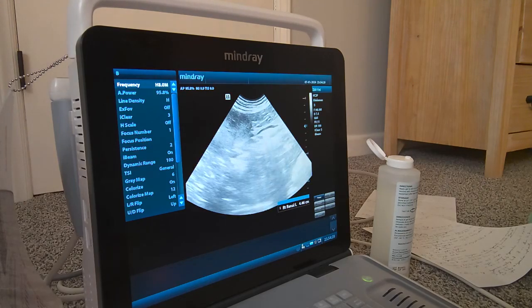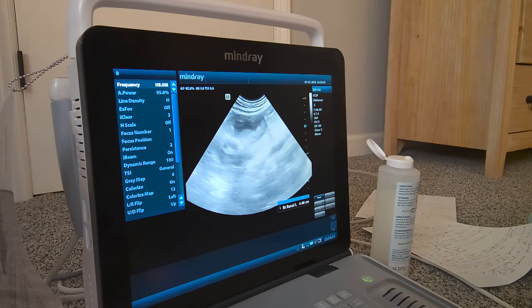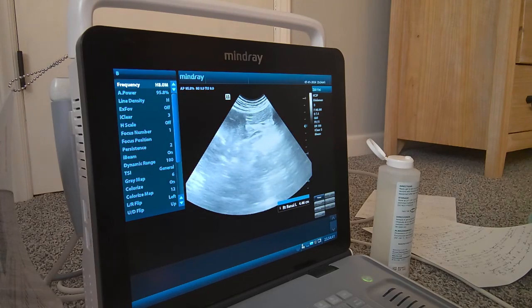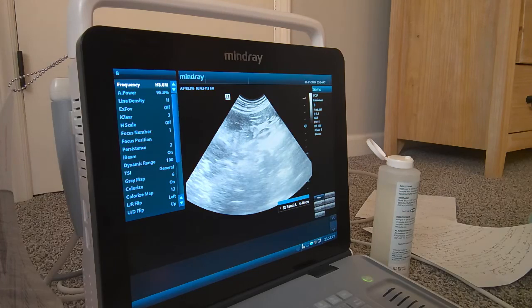So something to look for on there, we can see it with lepto or FIP. Ethylene glycol toxicity is a big one, with all that mineralization of the Bowman's capsule area. I think it causes that really big medullary rim sign that we'll see in them. So looking for those types of changes. Small kidneys can have hypoplasia, dysplasia, issues with that.